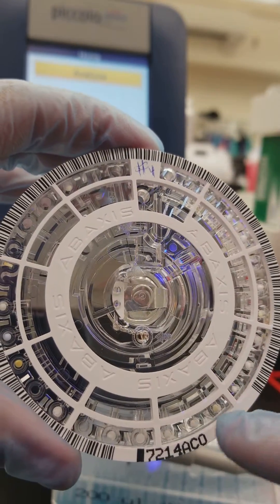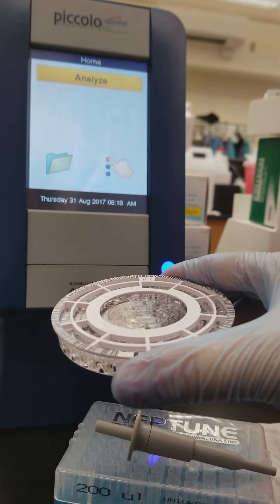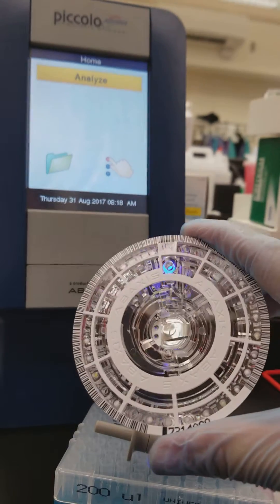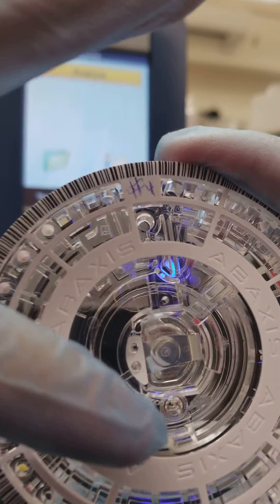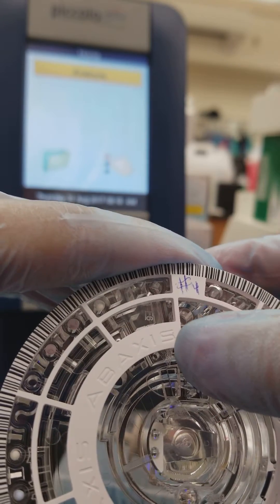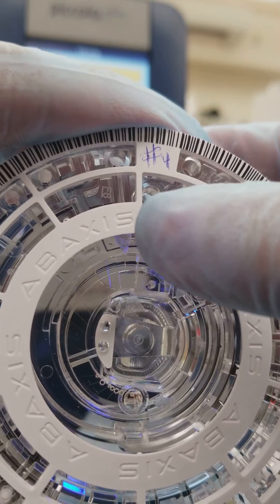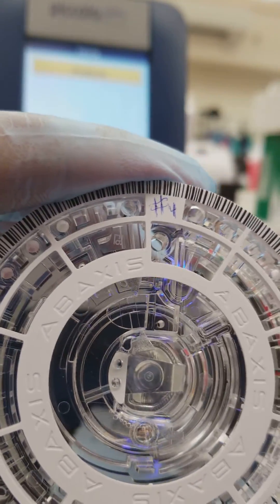These barcodes around the sides mean that as soon as you put it on the analyzer it's going to run QC and calibration to make sure your results are very accurate. The specimen is put into this little hole where the arrow is, and you tilt it when you do so. It should go up to this window here, this line. There are two little arrowheads right there — that's the fill line — and you want your specimen to go all the way to the fill line.